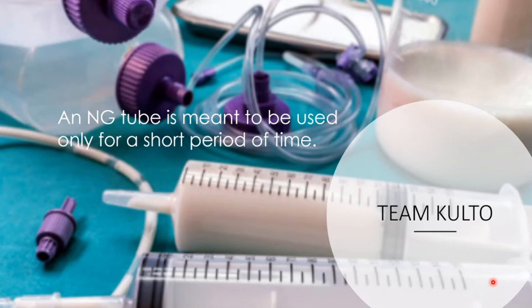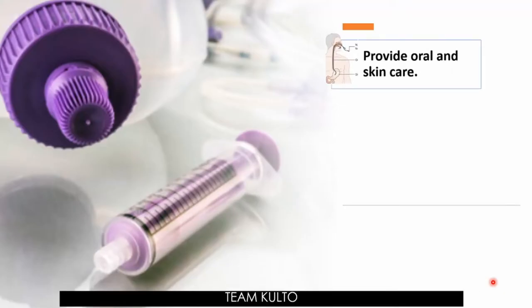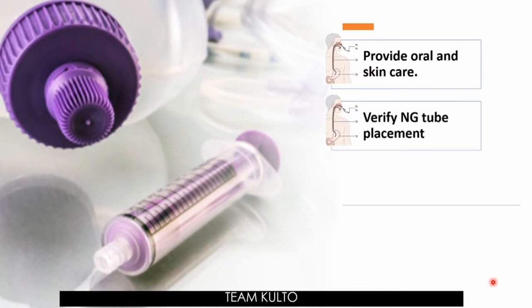Next, ano yung mga nursing considerations natin when we're trying to prepare or introduce an NG tube to our patients? First, we need to provide oral and skin care. Importante yon. Give mouth rinses and apply lubricant to the patient's lips and nostril. Using a water-soluble lubricant, lubricate the catheter until where it touches the nostrils, because the client's nose may become irritated and dry. Ano pa? Verify NG tube placement.